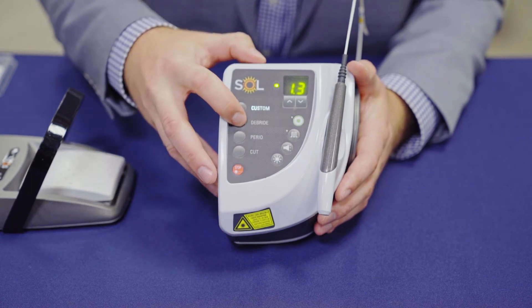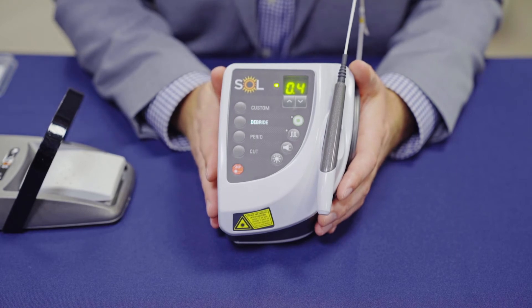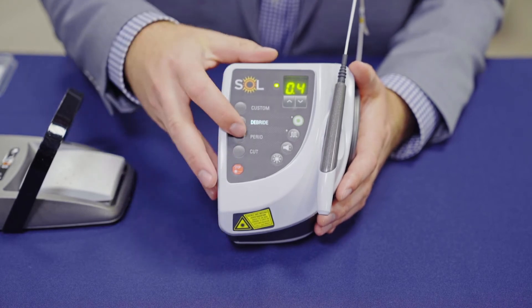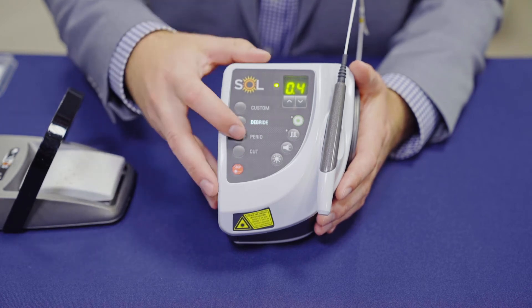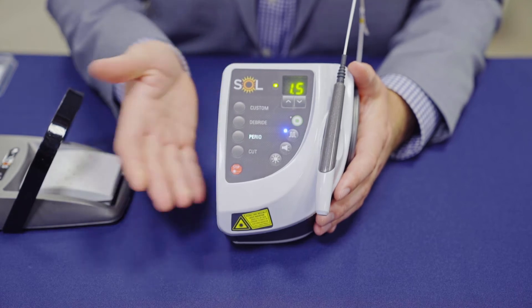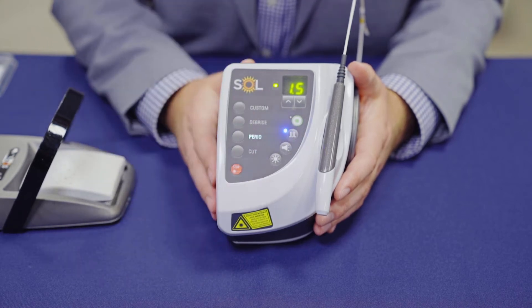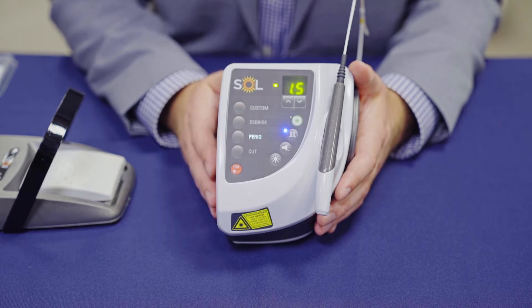The next preset is the debride setting — you'll notice that the wattage changes on the unit. For any hygienist or somebody wanting to use the Sole for hygiene, this is going to be a crucial function. This is the perio button. You'll notice a blue light that turns on here, which simply indicates that the wave is now in pulse mode instead of continuous wave mode.